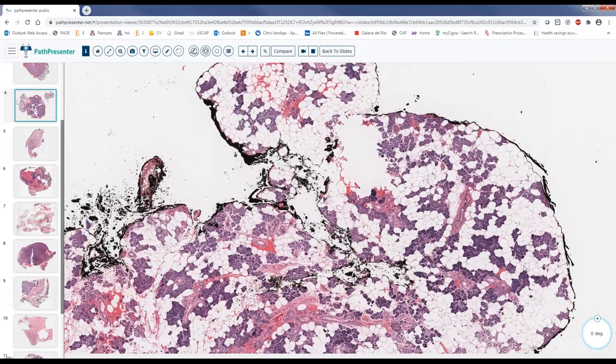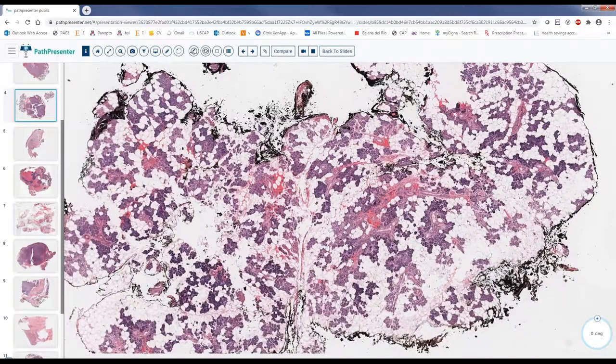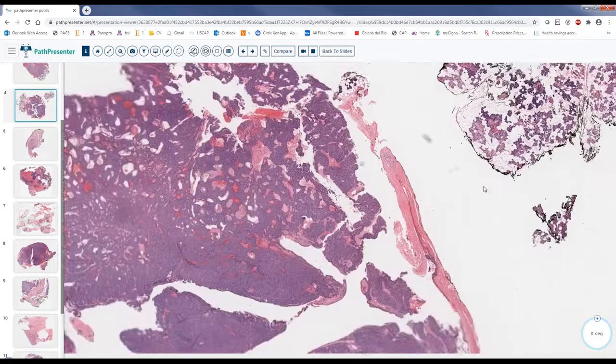Knowing the organ is very important, because sometimes patients mix up between the lesions. It's not like you have to do it routinely, but it can help to know whether I'm dealing with mucinous, serous, or mixed. So this is parotid gland.